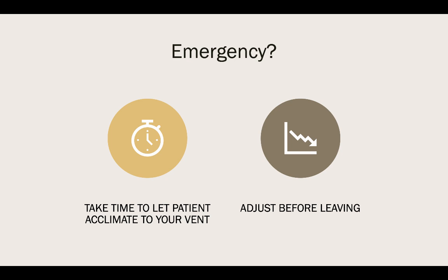This is not an emergency patient, right? They might tone you out for an emergency transport, emergency transfer, right? But is this really a time-sensitive emergency? Probably not. So flip them over to your vent, change them over to your vent. Let them acclimate to your vent. It's a different machine. You're not going to be using the hospital's standalone vent that your patient has become acclimated to. So give them some time. Give them a few minutes.